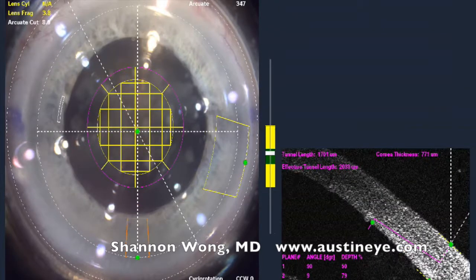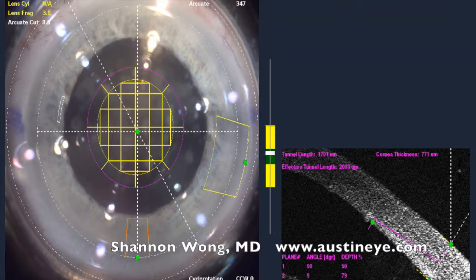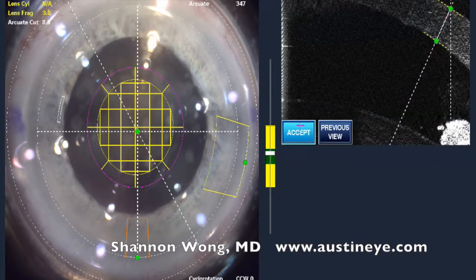Here, in the lower right corner, is a horizontal view of the corneal incisions that we're going to make — the astigmatic incision.